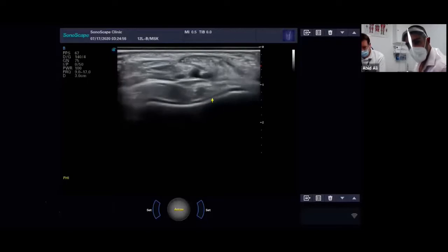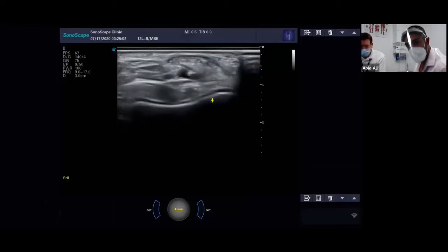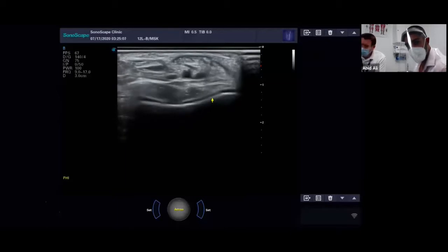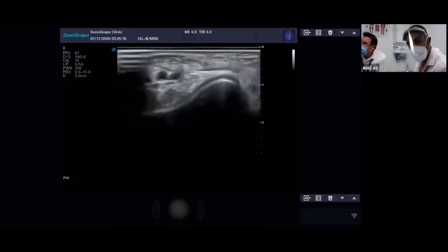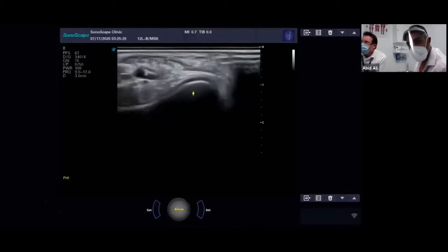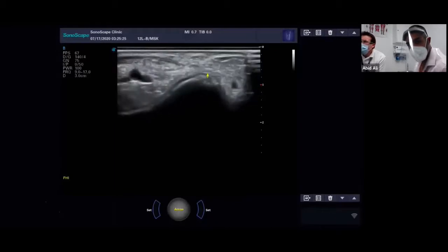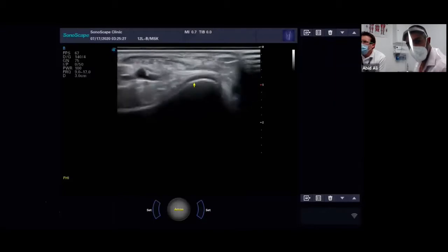cartilage. If you were to see degenerate features in there, obviously that won't be such a nice bright white line. It'll be a bit knobbly and bubbly, a bit wiggly, and there'll probably be slightly less definition of the articular cartilage. So you can see all the layers here. And then I'm going to move slightly more laterally, and you can just now see the lateral end of the head of the talus. You can pick up little osteophytes here quite nicely.